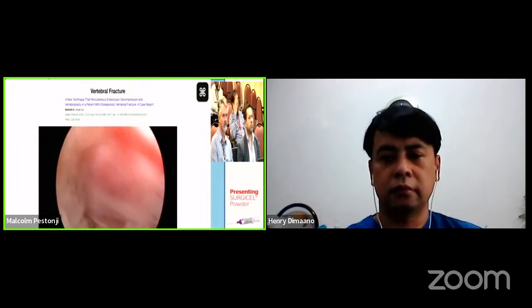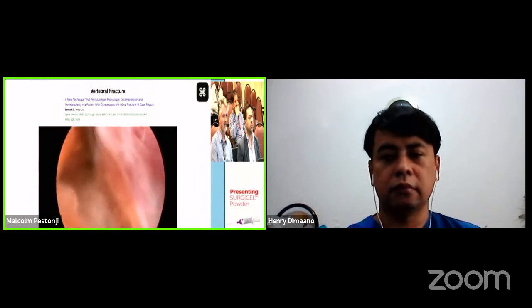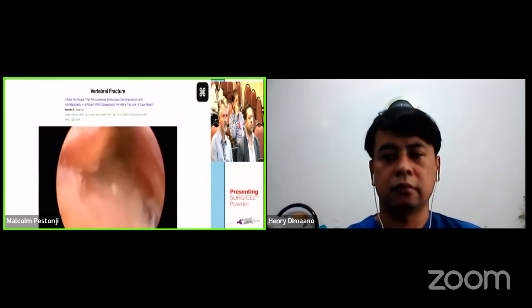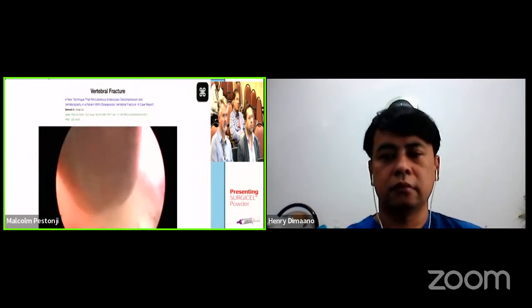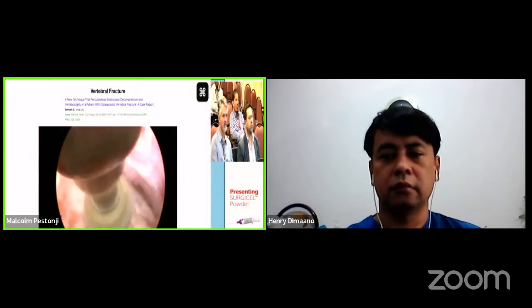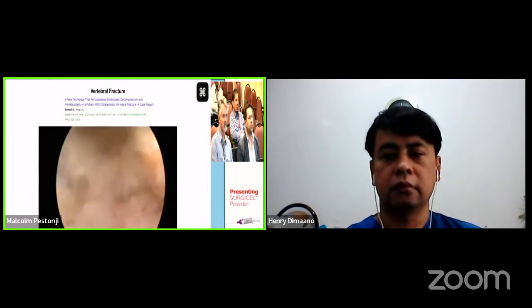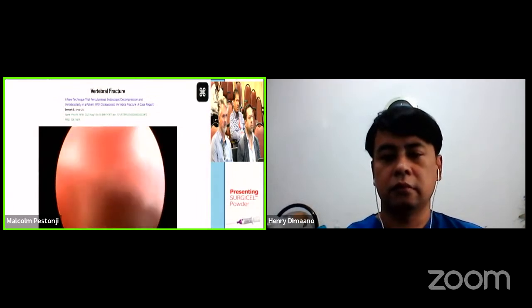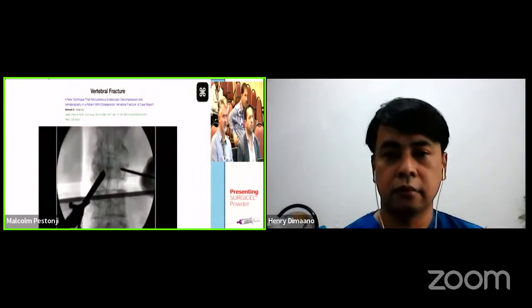Another translaminar approach. There is a nerve root. We are dissecting it, and here is fractured bone. We use a shaver to remove this part of bone, and here we use a protecting burr. This bone is pushing the nerve tissue, so we dissect the nerve tissue after we remove this bone.